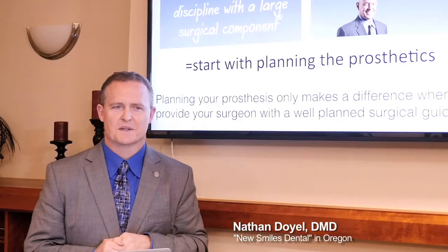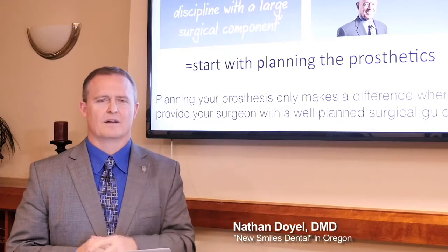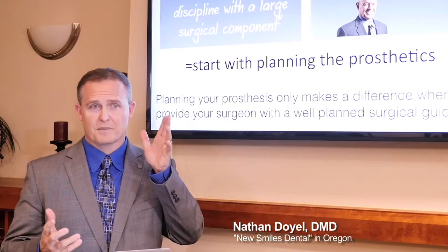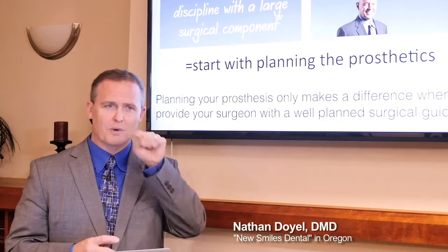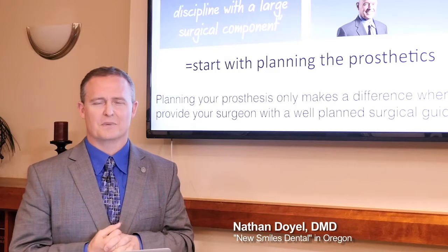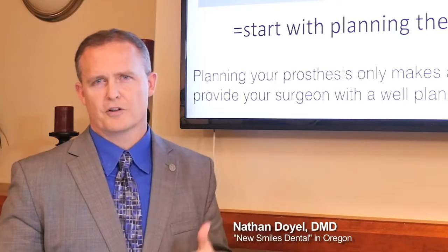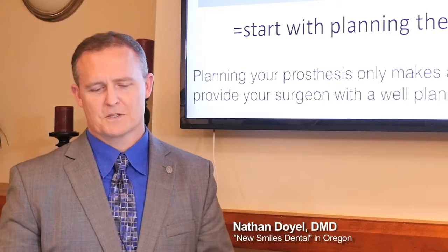We've seen cases where the implant was sticking out halfway through the buccal root of a tooth, or where it should be coming out the incisal area, it was coming out the buccal, and there was just no way of restoring that thing without being hideous. So in that case, we had to remove the implant and graft it all, then place it again later. So planning your prosthesis only makes a difference when you provide your surgeon with a well-planned surgical guide. If the surgeon doesn't follow your plan, then it's not really helpful. So you want to plan it well.